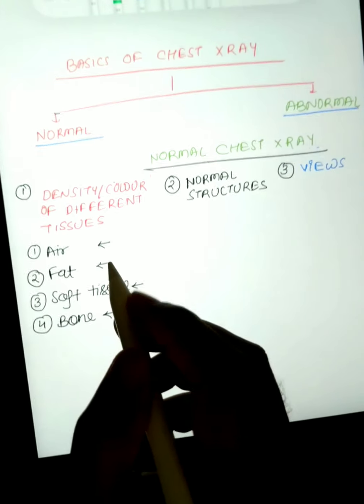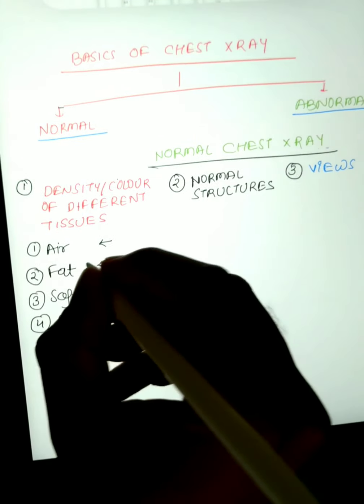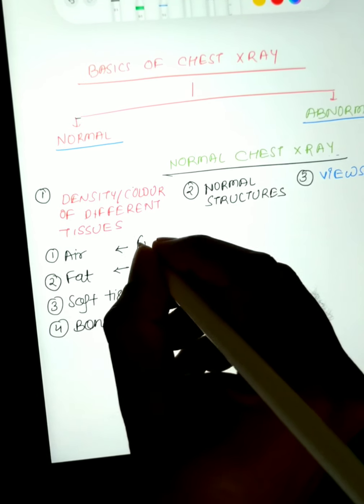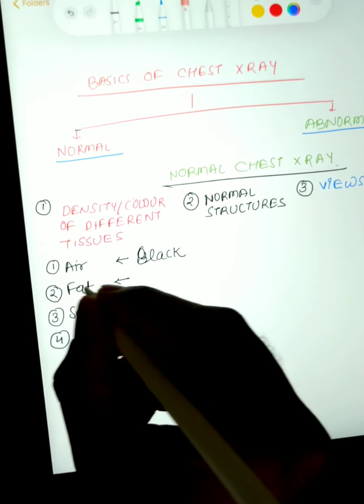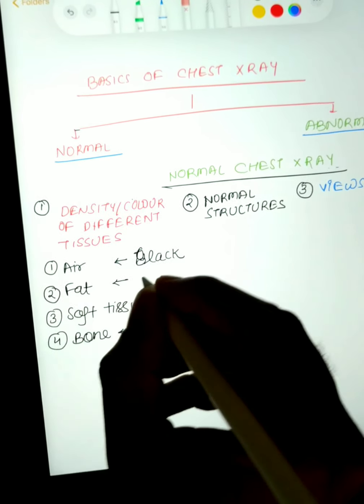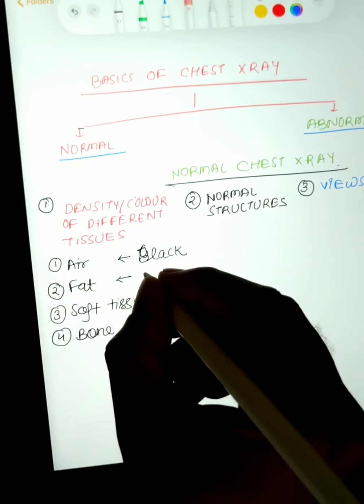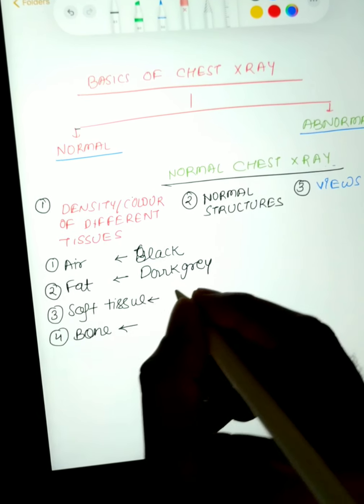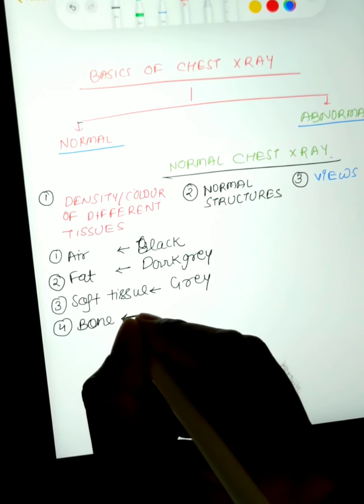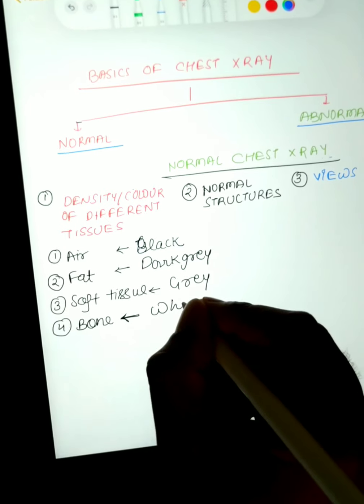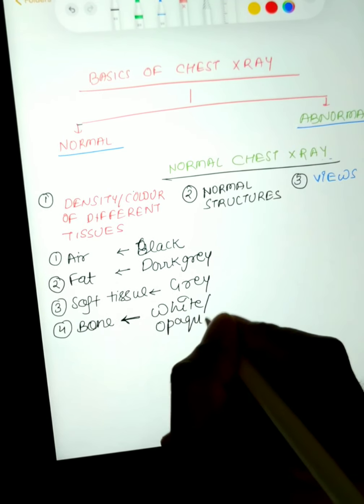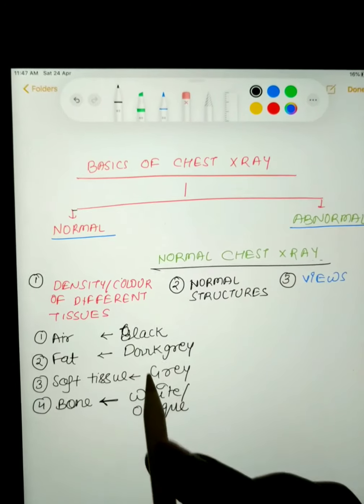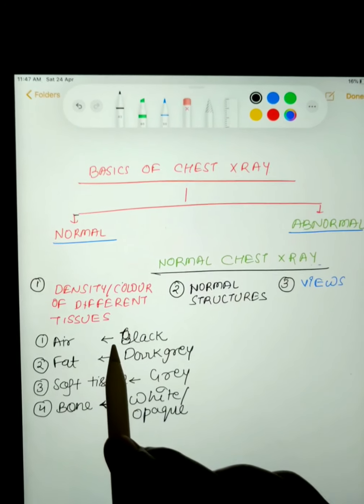The color of different structures — air, fat, soft tissue, or bone — depends upon the absorption of X-rays. Air has minimal to no absorption, so it appears black. Fat has minimal absorption, so it appears dark grey. Soft tissue absorbs somewhat more X-rays, so it appears grey. Bone has complete absorption of X-rays, so it appears white or opaque.